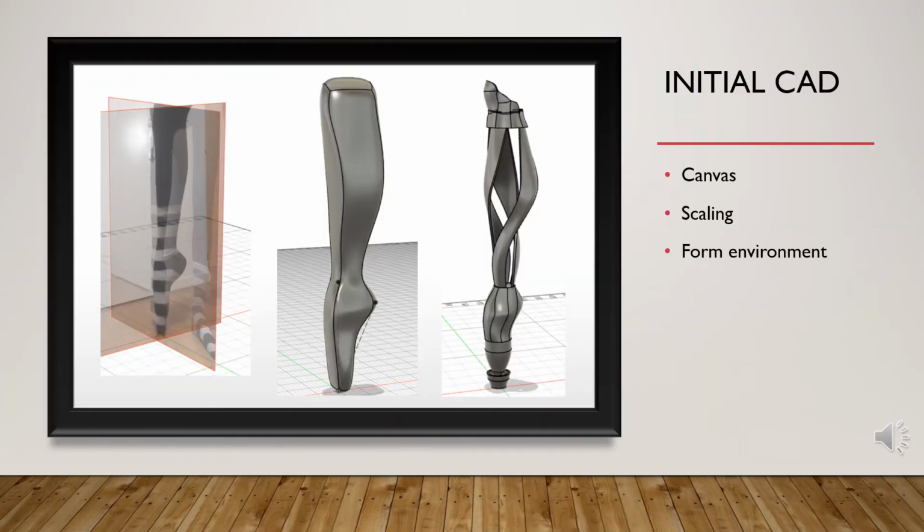To create the 3D model, I imported pictures of my own leg as canvases in Fusion 360 and used the form environment to create the shape. It would potentially be customizable. Appearance is also an important factor in ballet, so I made the components look like spirals, mimicking the ribbons, and to keep the more classical look, I made them follow the shape of the calf.